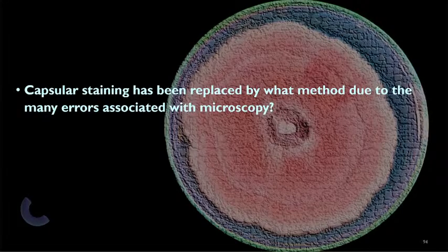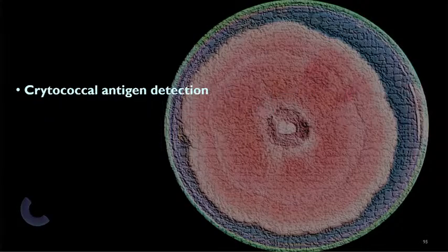Alright, now. Capsular staining has been replaced by what method due to many errors associated in microscopy? Obviously, we now have other ways to identify capsulated organisms. And because it's a capsulated organism, it has a lot of antigens. Therefore, we use cryptococcal antigen detection. Napakadali na ng buhay natin. So hindi ka na mamamroblema, Nigel. Magda-drop ka lang, magkuha ka lang ng sample mo. For example, CSF, because usually, cryptococcal organisms are diagnosed with this sample, as they go into the nervous system. And CSF is the sample of choice when you want to diagnose it.